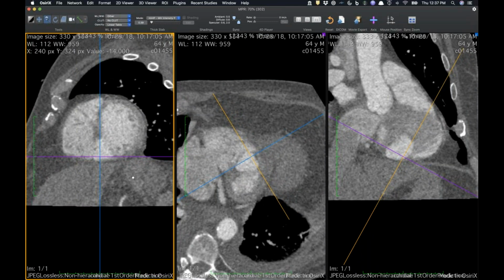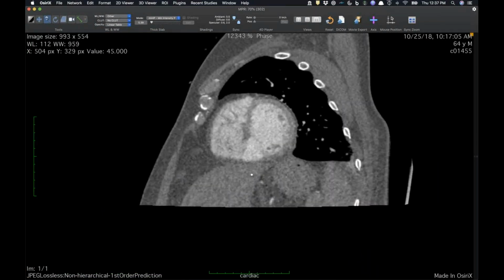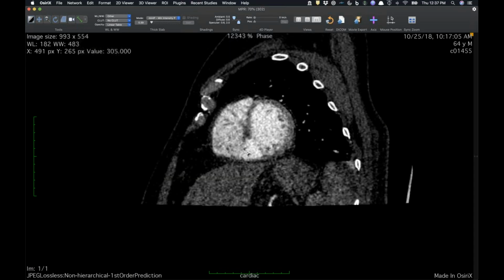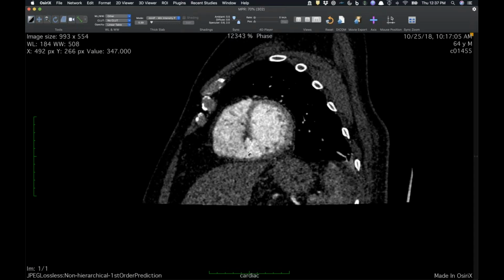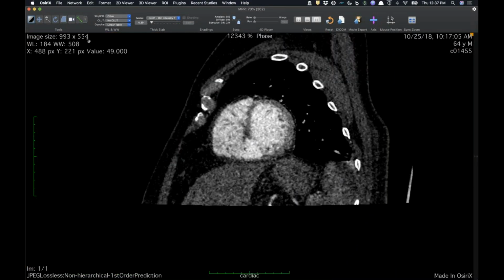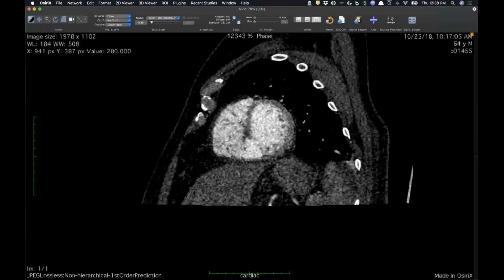Bothersome. Okay. So you struggle with measuring these too. What we do is retrospective gating, and we measure at end systole and diastole, and we had one case where we measured it, and their device was a millimeter off or something, and they were very upset because they went in there to plug it, and their device is 22 millimeters, and we read it as 21 millimeters, and it was 23 millimeters, whatever.